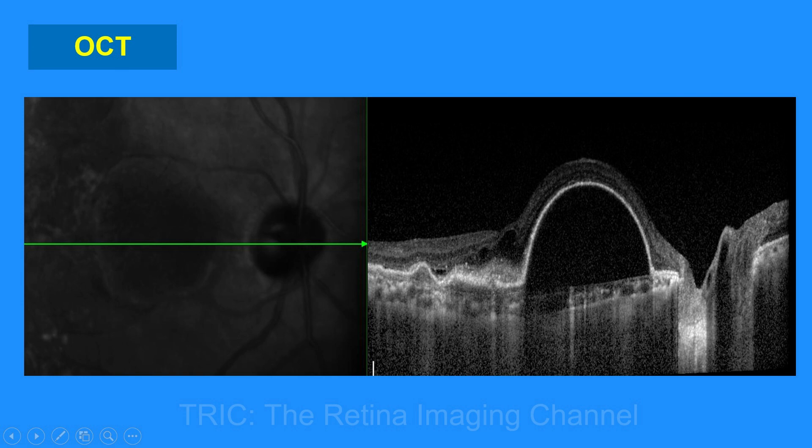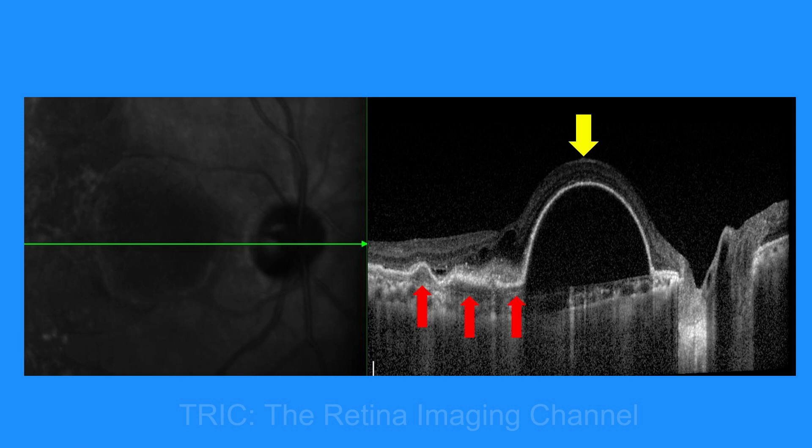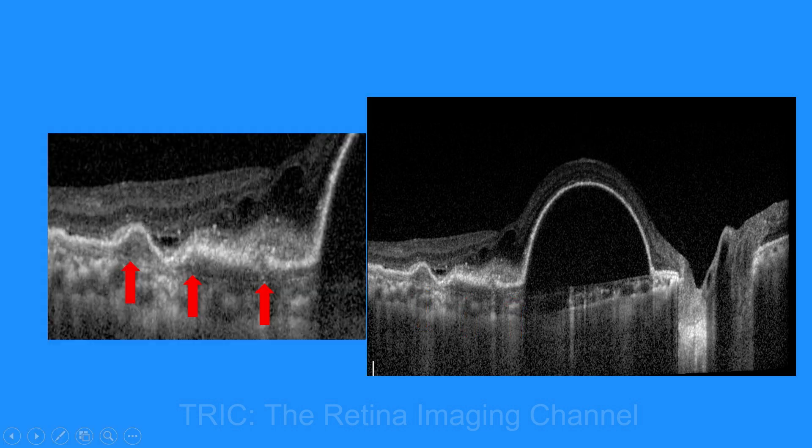Looking at the line scan through the PEDs, we can see that it is a serous PED, and just temporal to the serous PEDs there is RPE undulation. This RPE undulation is shown here with red arrows. Beneath that RPE undulation there is another very faint line, which is basically the basement membrane of the RPE — and that is called a double layer sign.